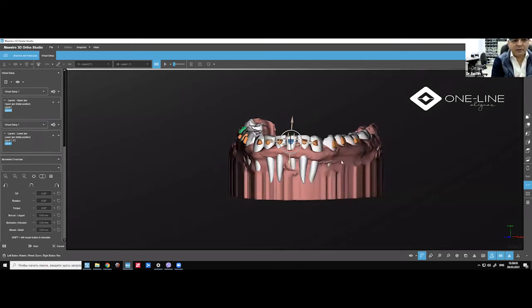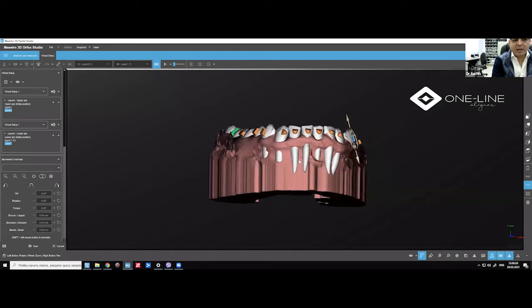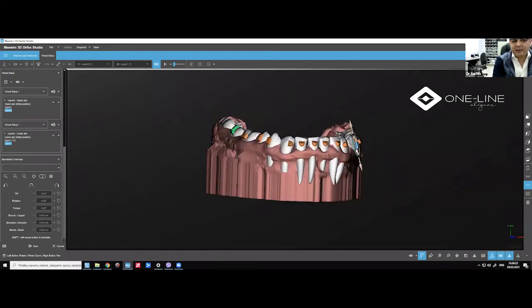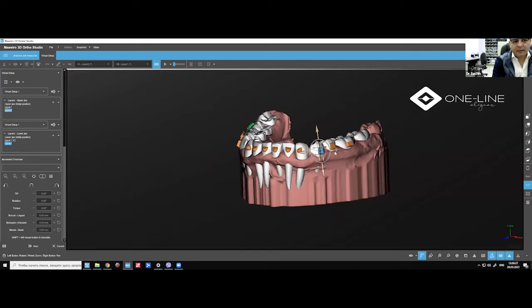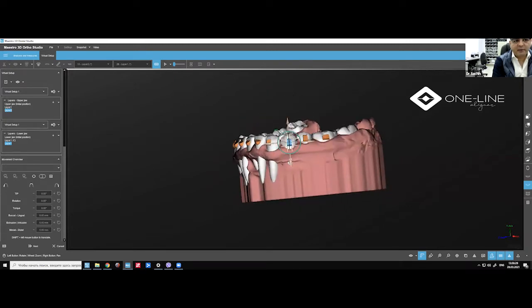The same way, if you see the rectangular bevel ones, you have a 90-degree bevel, 90 degree here, and the upper is bevel, right? So if you move them 90 degrees, 180 degrees, right? The retention has gone almost half. So that is the reason. When you want retention, you should have the surface which is near the gingiva, which is flat. So the aligner will come and hold, but the upper part will be pressure forming, right? Not the one which will hold the aligner.